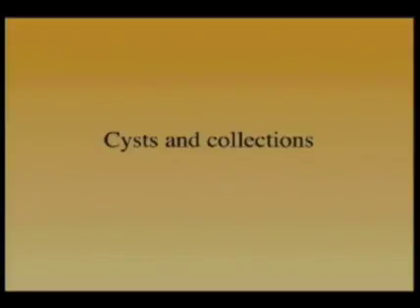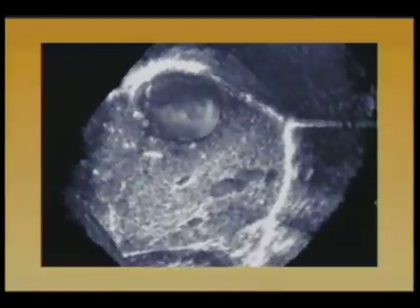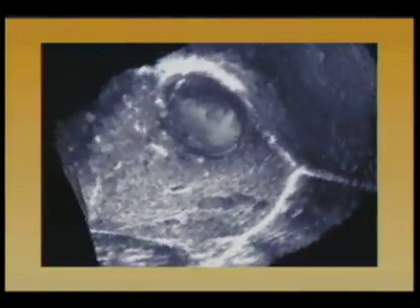Fluid-filled cysts and fluid collections in the abdomen also are potential targets for 3D ultrasound imaging, including this hepatic cyst, which, as we pan around in 3D, we can see the walls of the cyst from various perspectives.